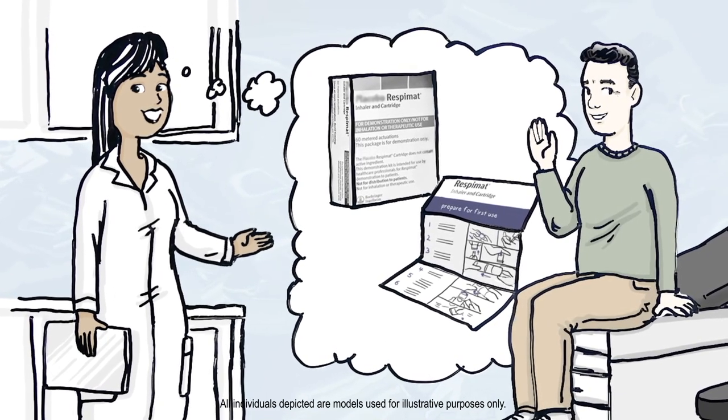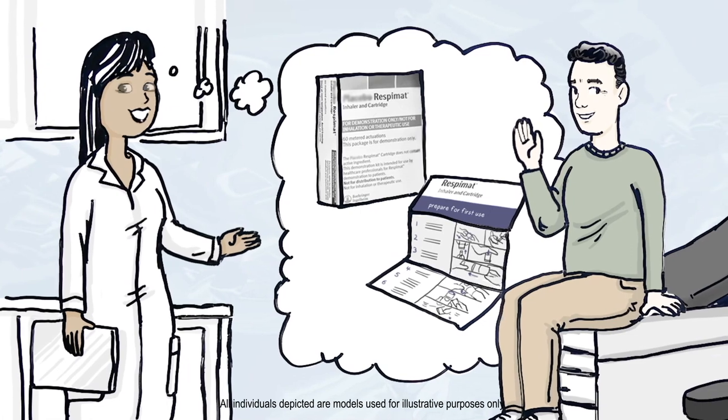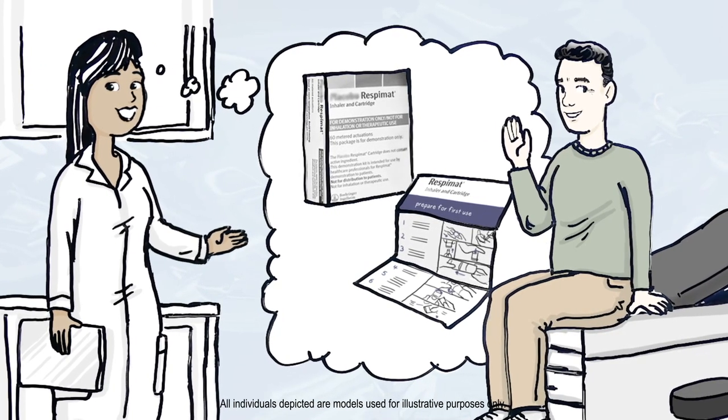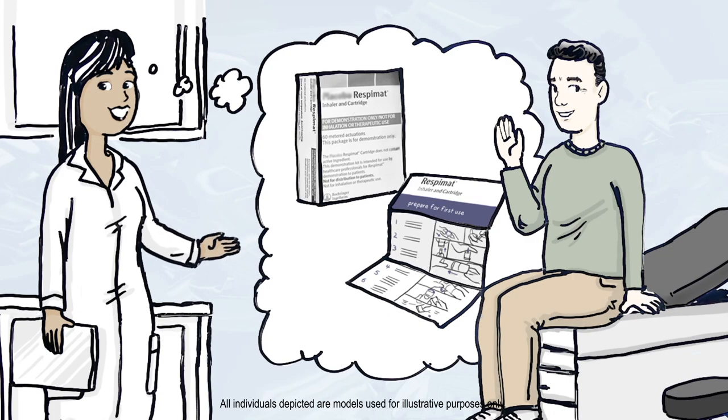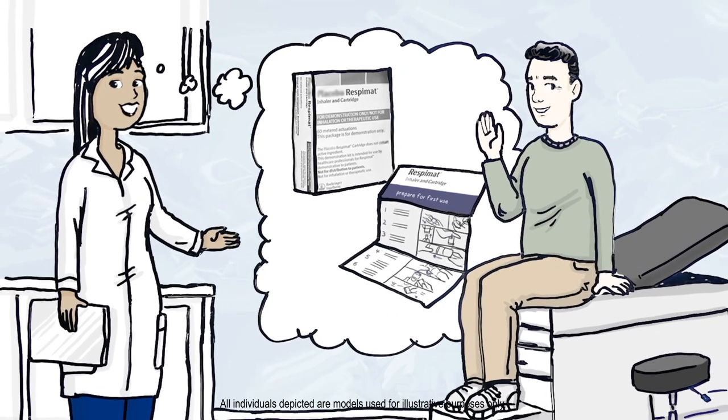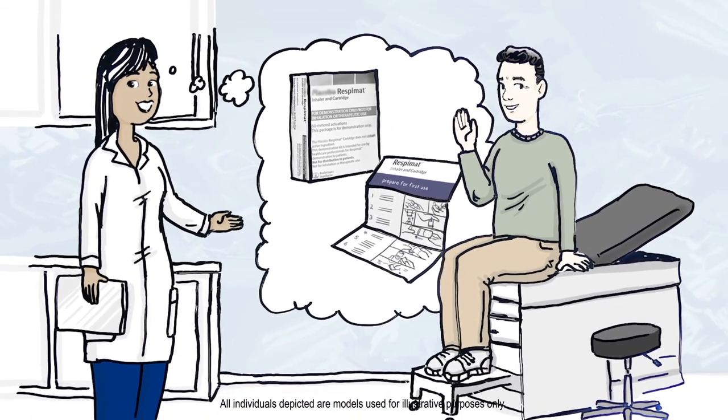Today I'll be working with Henry, a patient like you. This is his first time using the Respimat Inhaler. We will be going through the steps of using the Respimat Inhaler together so he can become familiar and feel comfortable using it as part of his treatment plan.